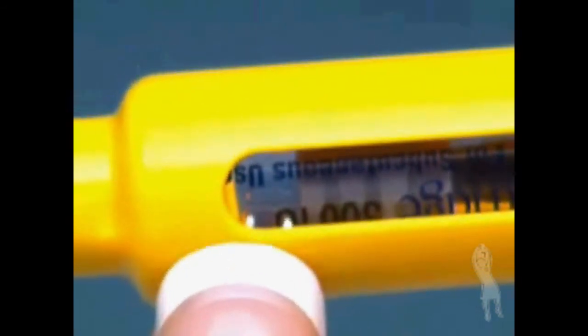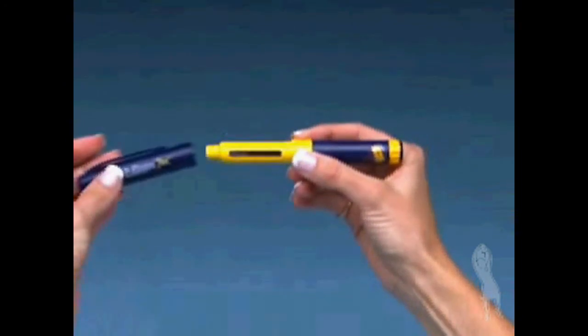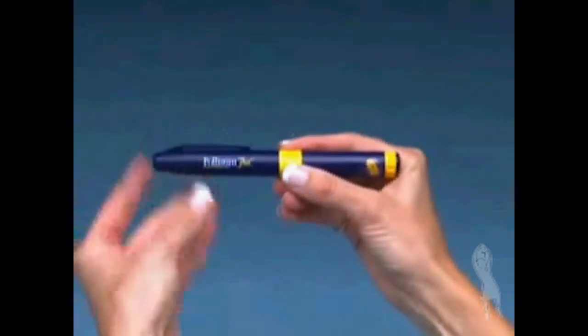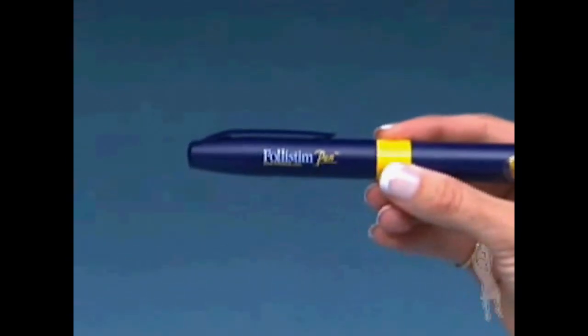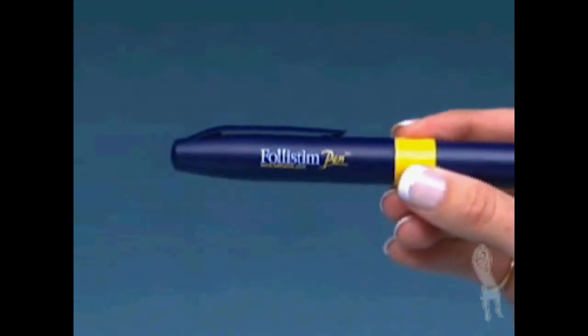If there is medication remaining in the Follistim AQ cartridge, put the pen cap back on the pen body and store your Follistim pen in a safe place in the refrigerator or at room temperature. Never store the Follistim pen with a needle attached to it.